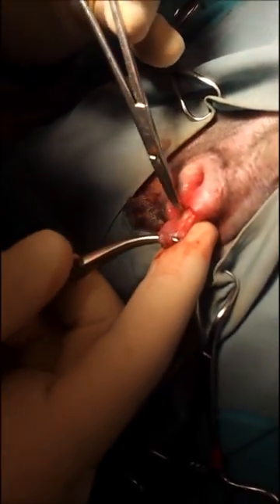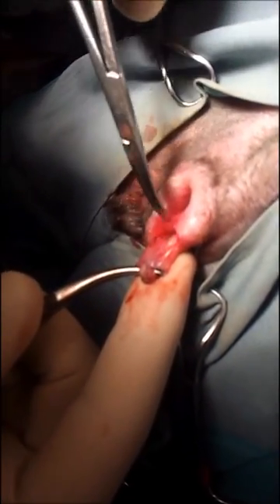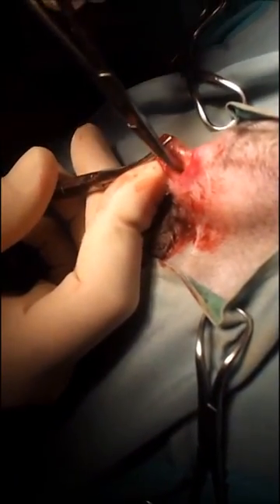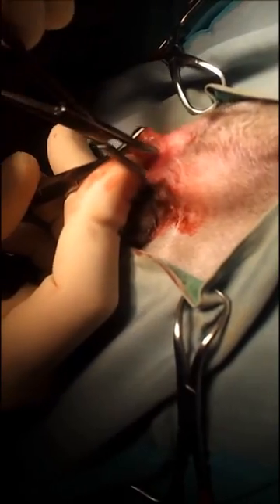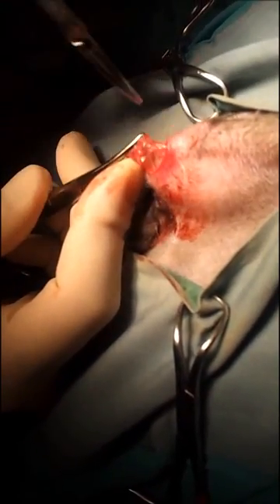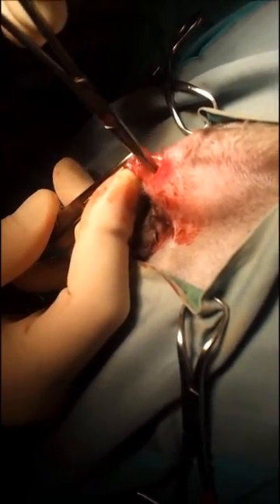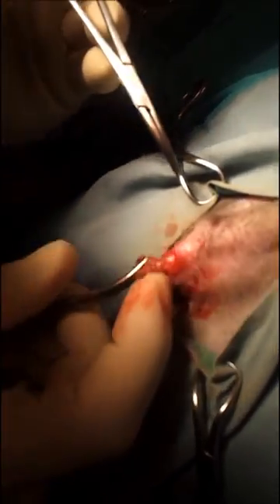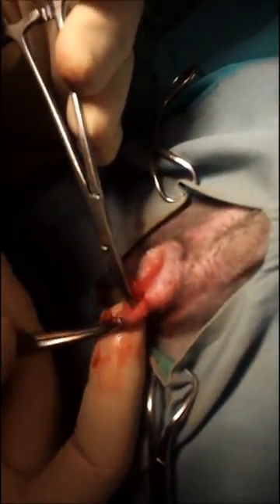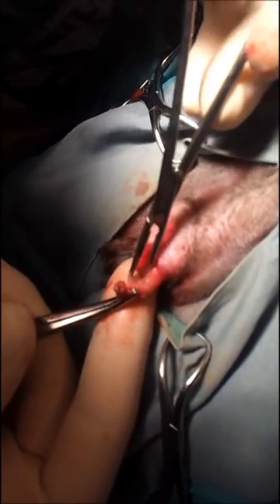Now this happens to be a cat, which is a lot harder of a procedure than a dog, because in a dog the gland is much bigger and more obvious. If you do this procedure on a ferret, it's even harder, because the glands are smaller and the ferret usually weighs less than a kilogram — so you can imagine how small those glands are. At the same time, pound for pound, they're more developed in a ferret, so in that sense that helps a little bit too.